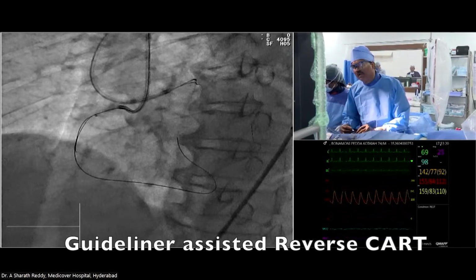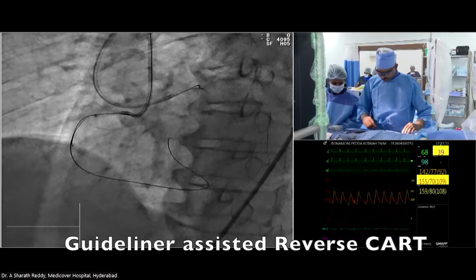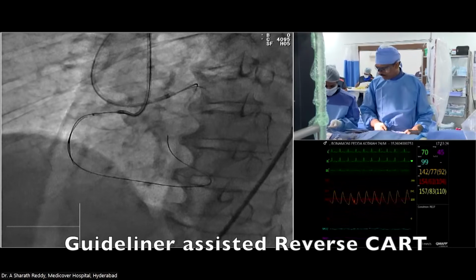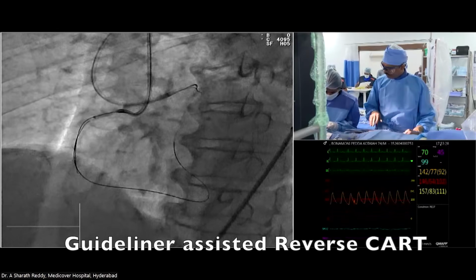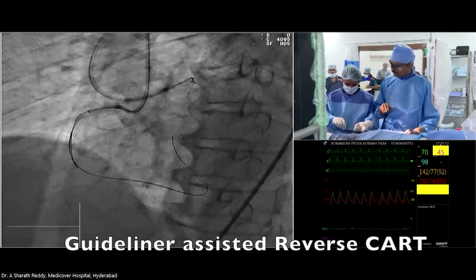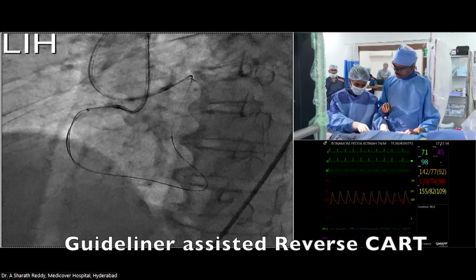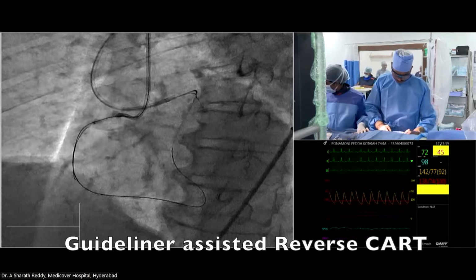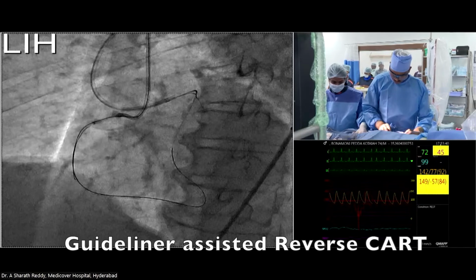We advanced the microcatheter into the guide extension, followed by externalization with an RG wire. Once externalization is done, the next part is like any other regular angioplasty, nothing great here.